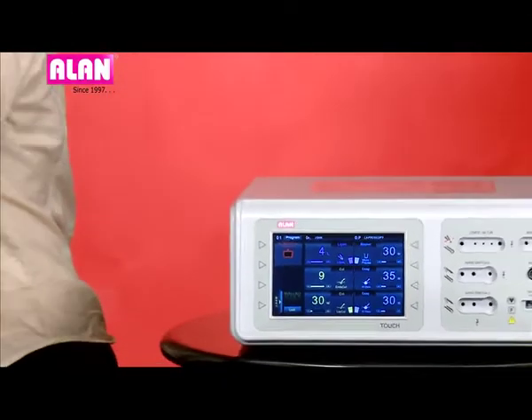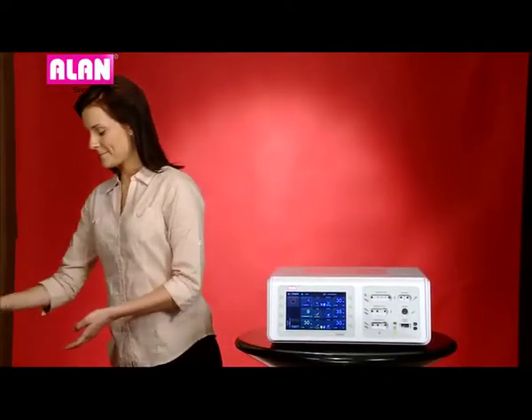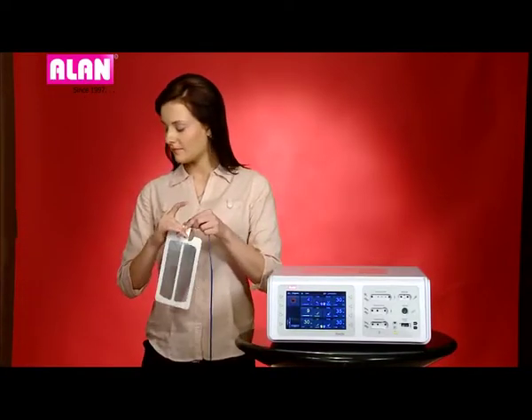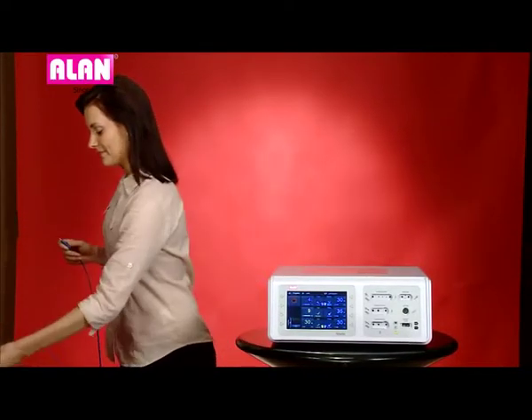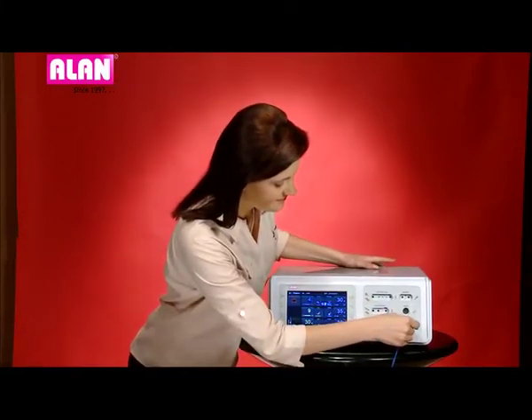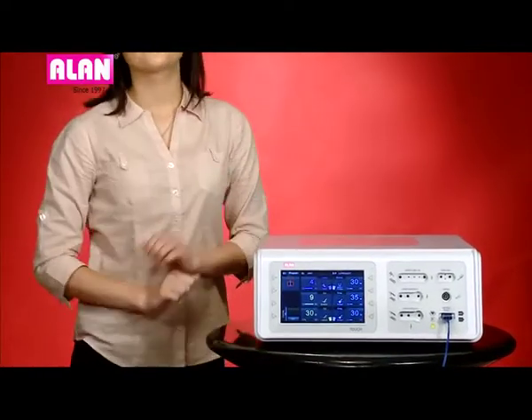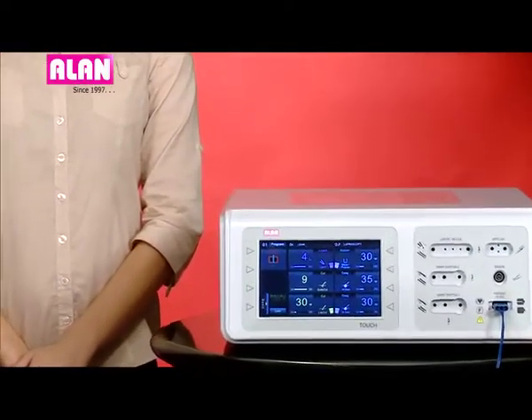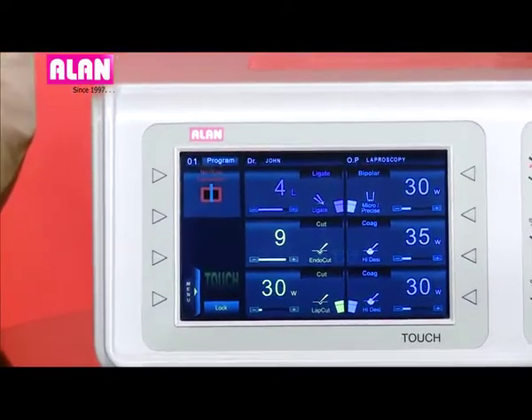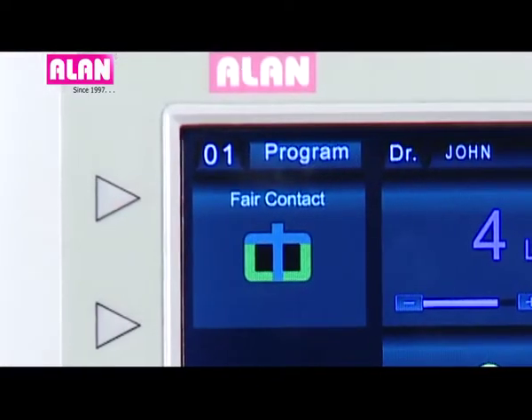This unit supports both non-split as well as split-type patient plate. Alan strongly recommends split-type patient plate for maximum patient safety. The patient plate cable is connected to patient plate port. If split-type patient plate is used, the status window shows the quality of contact with patient.